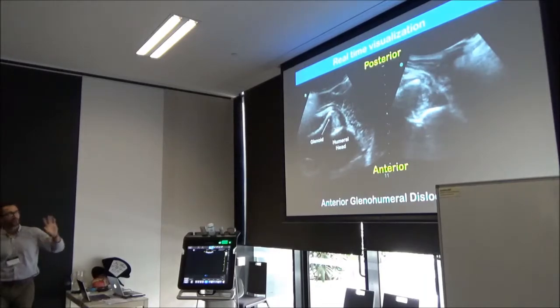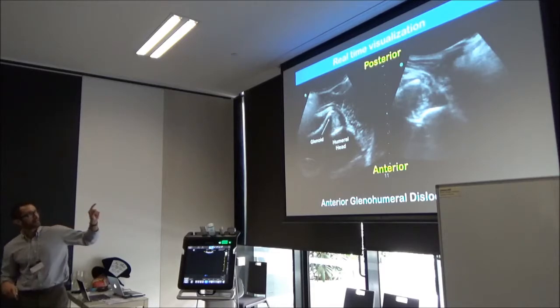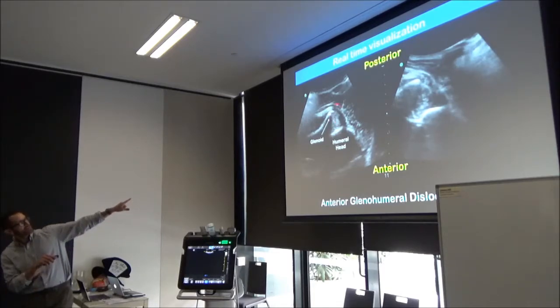This is kind of a cool video, I'm going to show this. So this is us blocking a patient, I'll go over how to do this. And you can see the anterior dislocation, correct?